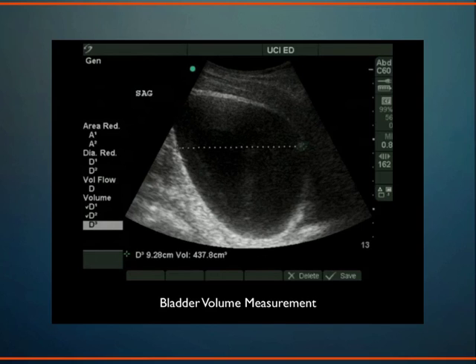The other thing is, on the other end of the spectrum, somebody comes in with acute urinary retention. They say, hey doc, I haven't peed in 24 hours. And it's really easy to just say, okay, chuck a Foley in that guy, throw a catheter in that guy, and then tell me what comes out, which is sort of an easy thing to tell a nurse to do. But what if the bladder's empty because they're actually in acute renal failure, and they just underwent, in an adult patient, it's extremely uncomfortable to put somebody through a catheterization process.